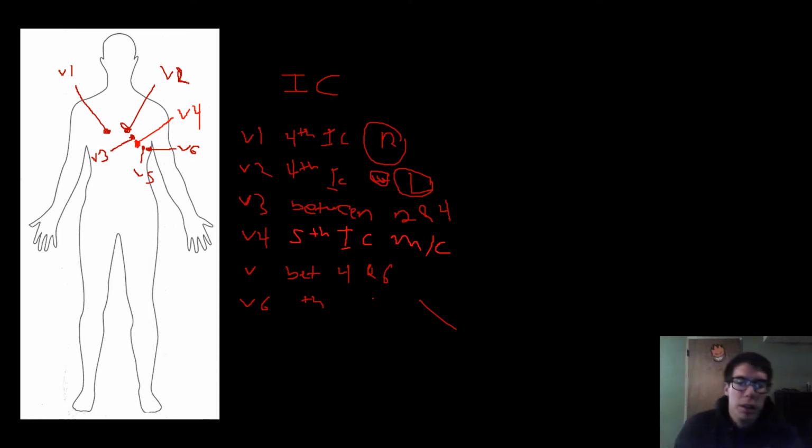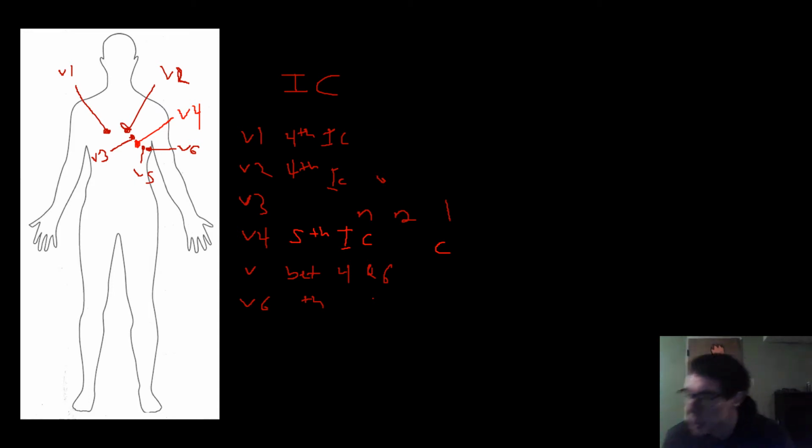All right, so now we're going to talk about waves really quick, as well as intervals and segments.